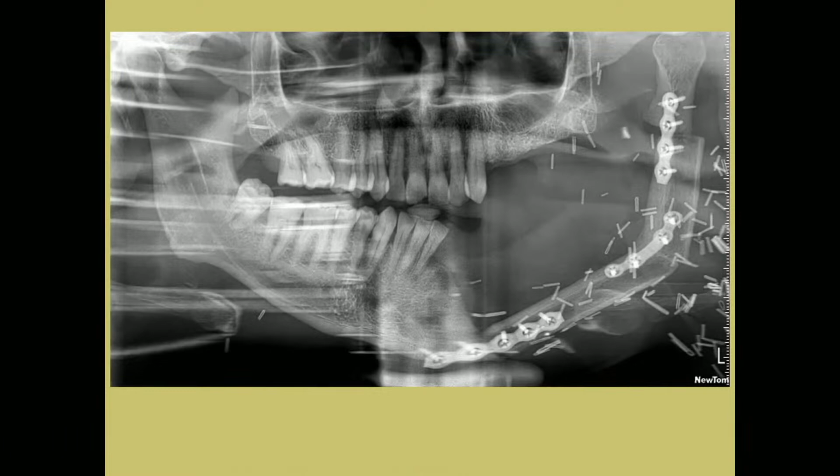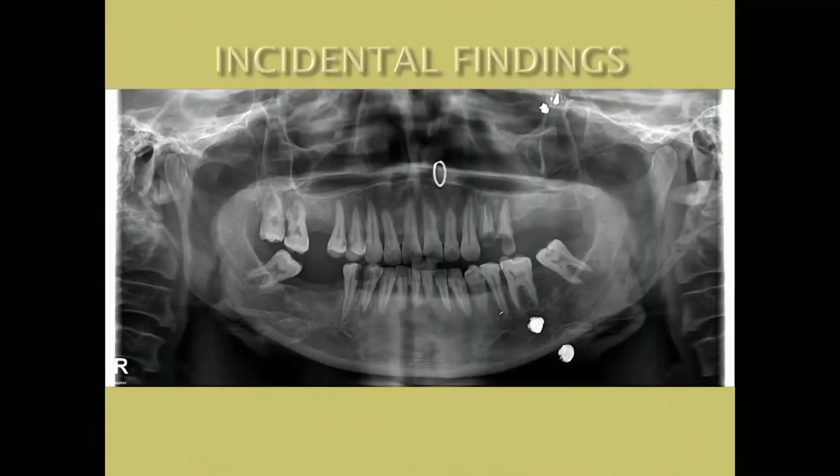This is a case of a CA with reconstruction. This was a case which actually came to my college, and I was taking this into consideration, and the students were asking, what is this, ma'am, what is this? And we took a history, and this is actually a bullet, because just see the radio-opacity.